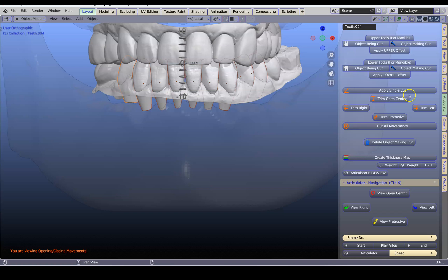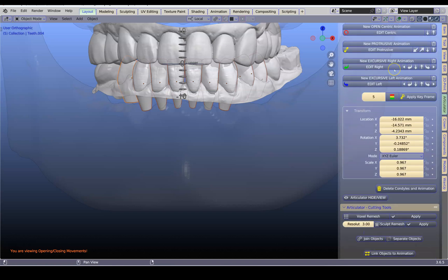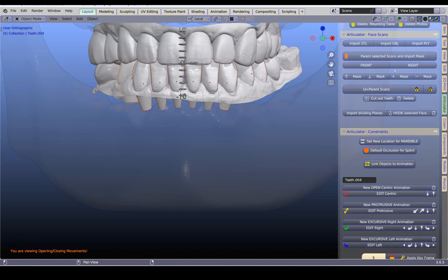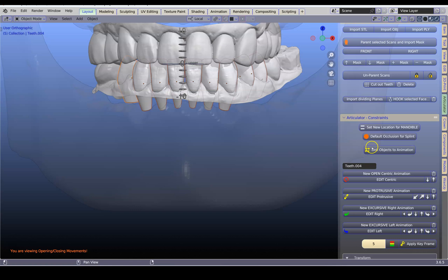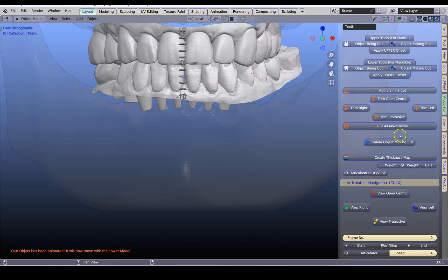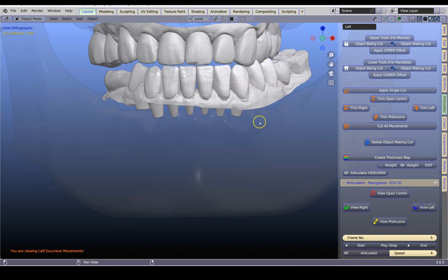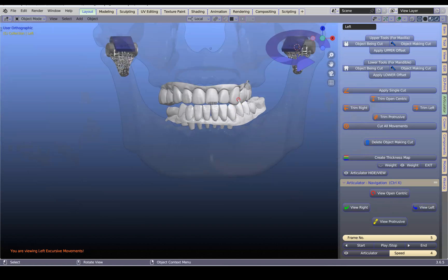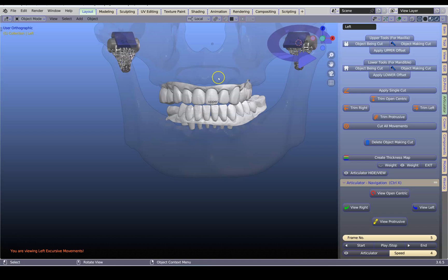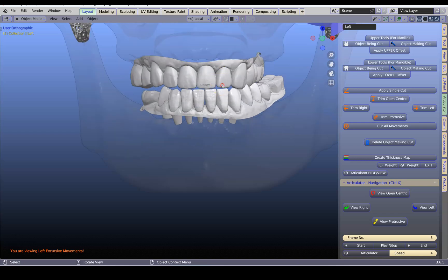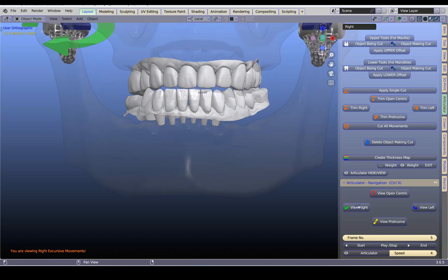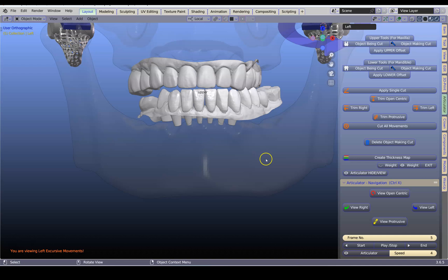This is very easy and straightforward — our videos actually show you how to do this. This button here: Link Objects to Animation. If I do this now, they've been parented — not to the model, there's actually a little cube here which it's been parented to.